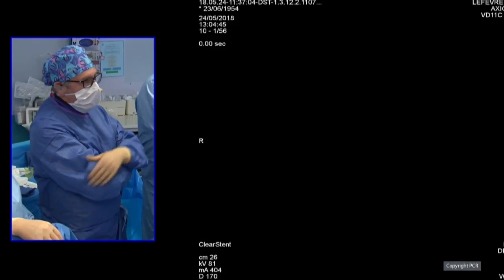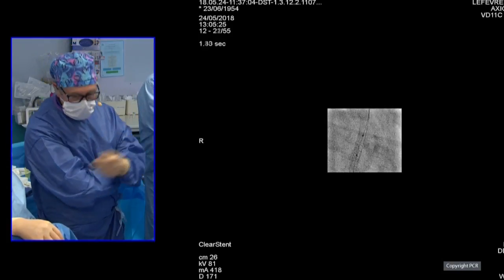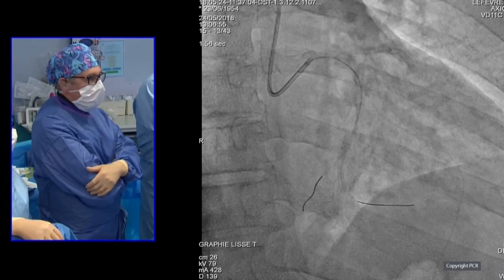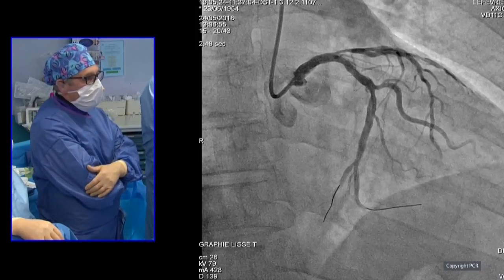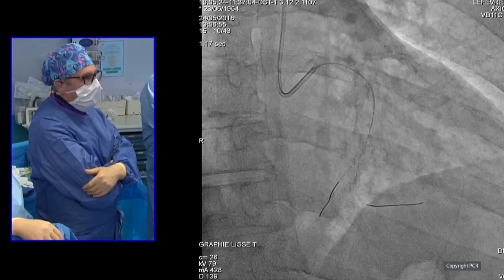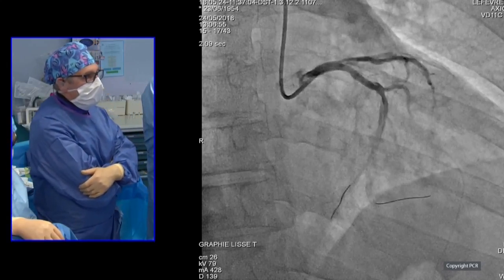So this is a positioning using a stent enhancement of the balloon at the level of the carina, and then proximally in order to do the POT everywhere. So you have already a first bifurcation case, which was done with a very simple technique, with 1 stent crossover plus POT. And we have not opened the strut in the side branch because it's smaller than 2.5, and we have no significant disease in the side branch.